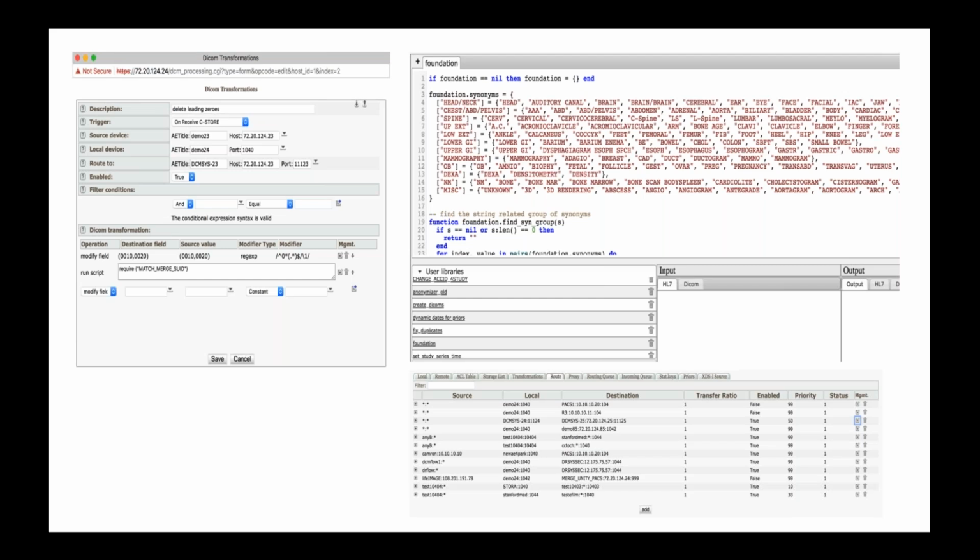We needed to prefetch the old system, migrate the MRN, and then store it in our PACS. So the migration of MRN, for those images we were prefetching, had to happen real time. So we were able to write a rule that accepted an HL7 message that included the new and the old MRNs, and we could migrate or transform that information in the DICOM in real time.